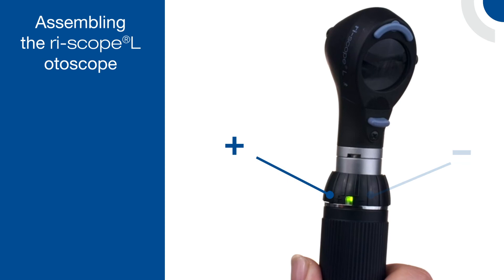There is a plus and a minus sign on the handle. Twisting clockwise or towards the plus symbol will immediately turn the device on to full power and a green light will illuminate.